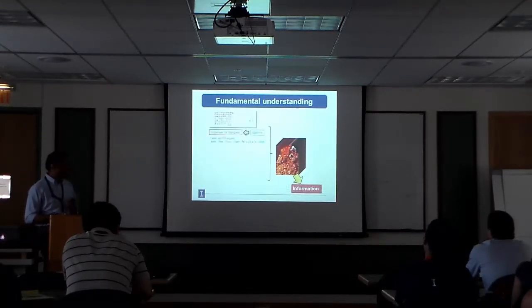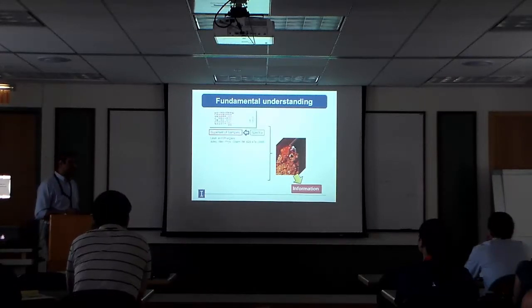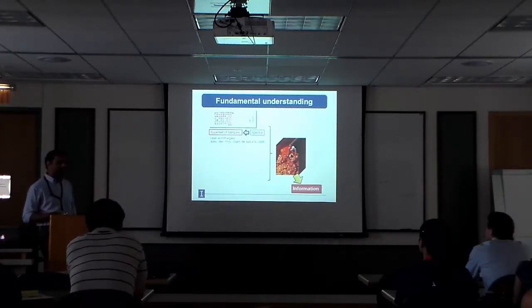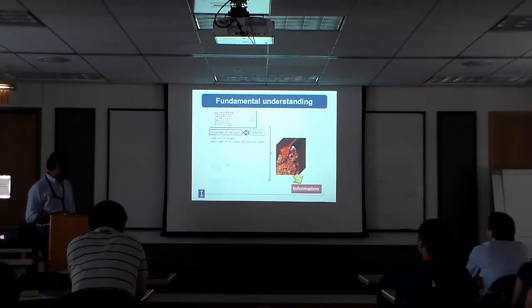The second thing we do, or we take two different approaches, is we validate our results on fairly large data sets. I don't know if you've seen this before, this tissue microarray concept. Back when we started doing this work, I built the first tissue arrays by hand. So we take a needle, put it in a block of tissue, pull it out, and stick it in a paraffin block and then cut those. Now this is done by robotic arrayers, right? So robots can make 1,000 samples per glass slide or something like that. The first ones we made were 16 on a glass slide. So this technology has also come a long way.